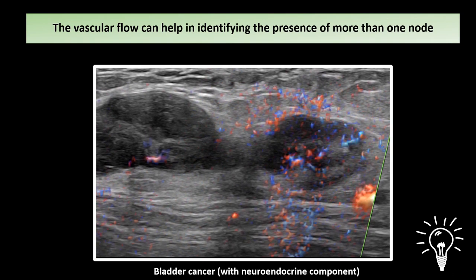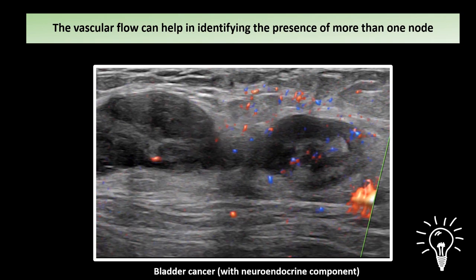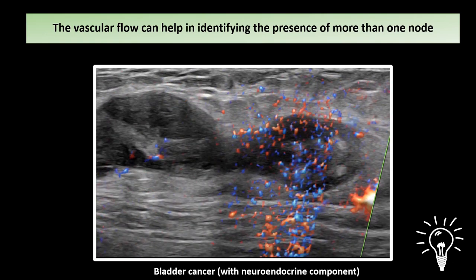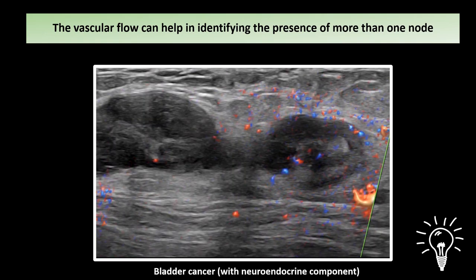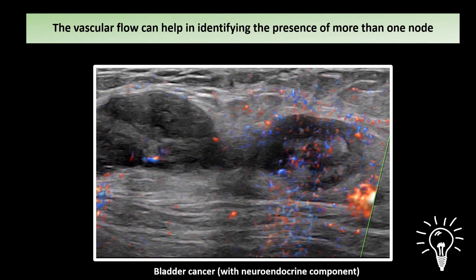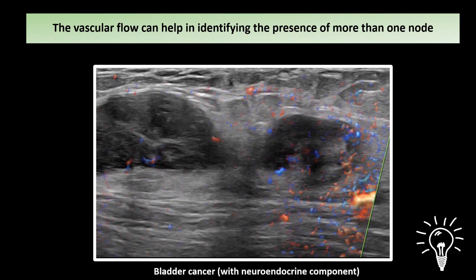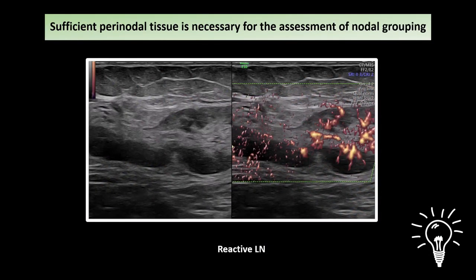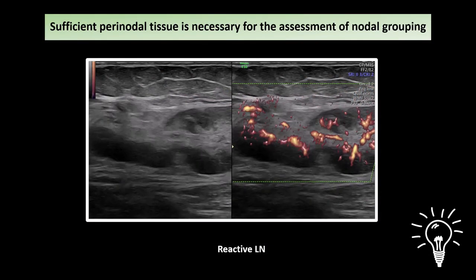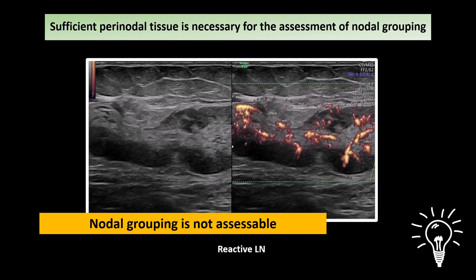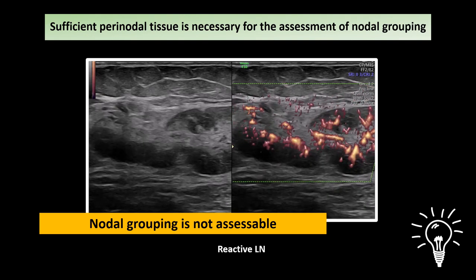It is not always easy to decide if an ill-defined mass represents multiple lymph nodes merged together or a single large lymph node. In these cases, color Doppler can help — for example, in grouping infiltrated lymph nodes from bladder cancer, two different hilar vessels are clearly visible in the dotted circles. To determine grouping in video clips or static images, sufficient perinodal tissue is necessary; otherwise, nodal grouping is not assessable.